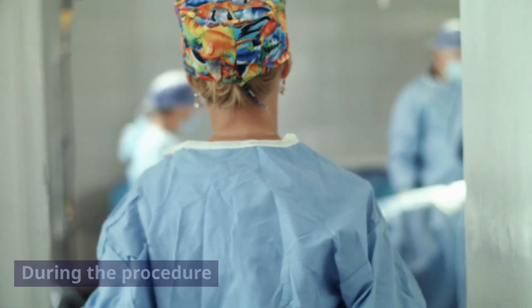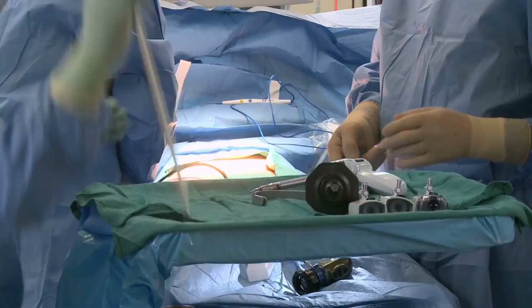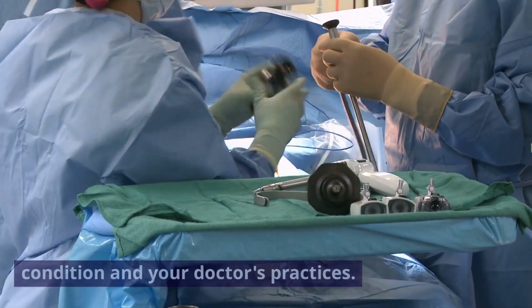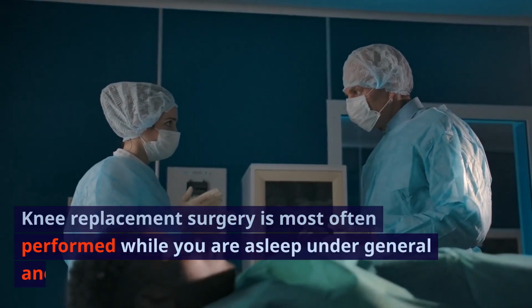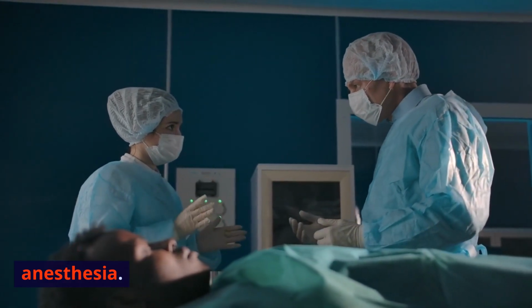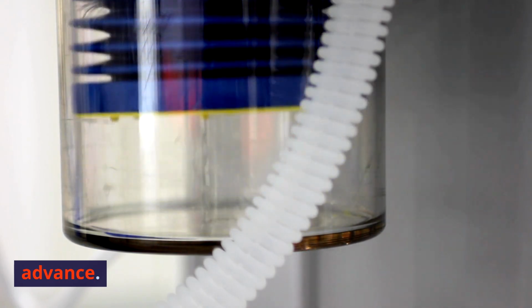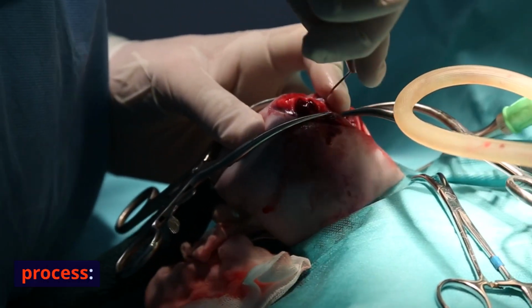During the procedure. Knee replacement requires a stay in a hospital. Procedures may vary depending on your condition and your doctor's practices. Knee replacement surgery is most often performed while you are asleep under general anesthesia. Your anesthesiologist will discuss this with you in advance. Generally, knee replacement surgery follows this process.